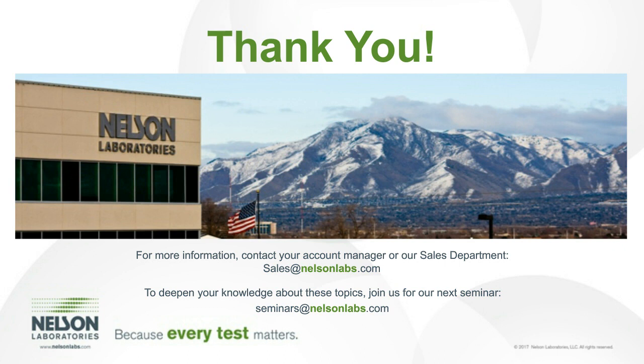Okay, thank you, Alpha. Next question here: is there a specific standard that we can use to refer to when deciding test soils for cleaning validation of reusable medical devices? Yes, the ASTM F3208 was just published in March, and that goes through all the test soils that are used for reusable medical devices. It also categorizes what type of test soils you can use for what type of devices. So it is a very good document that can give you information on what type of test soil should be used for the validation.